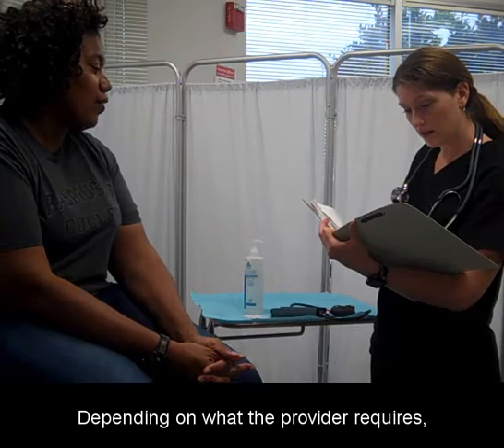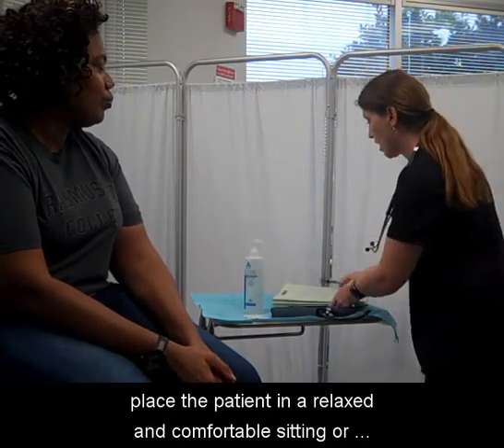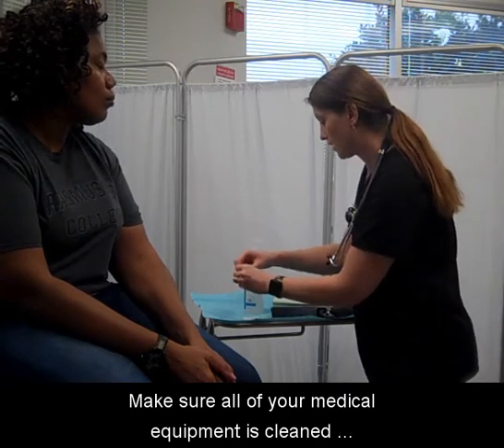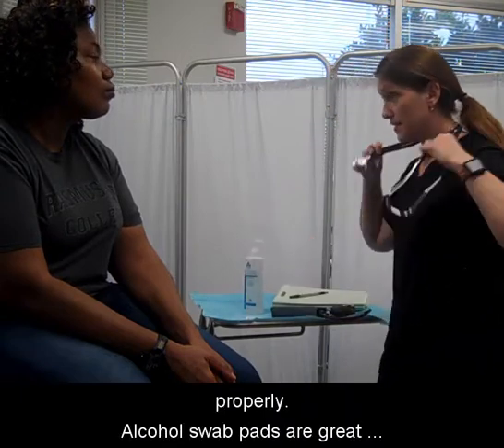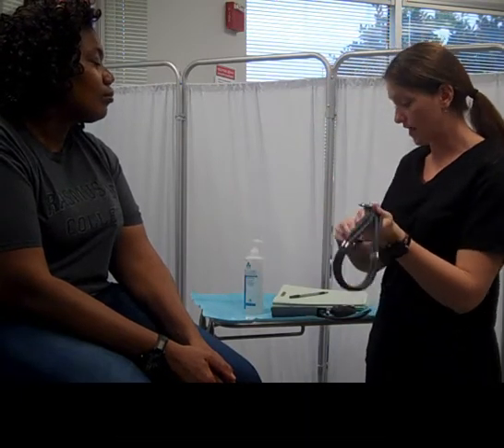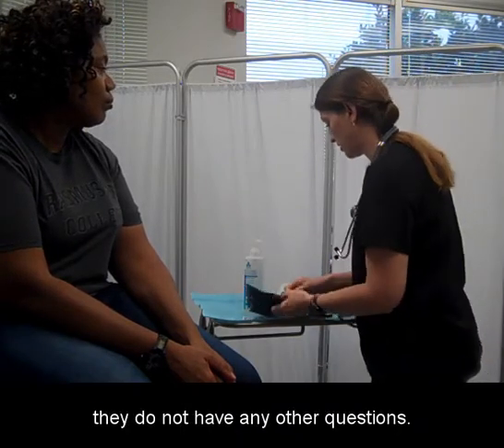Depending on what the provider requires, place the patient in a relaxed and comfortable sitting or lying position. Make sure all of your medical equipment is cleaned properly. Alcohol swab pads are great for cleaning quickly. Explain the procedure to the patient and make sure that they do not have any other questions.